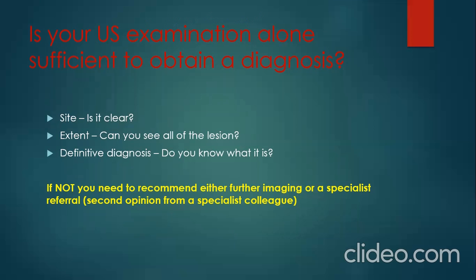After you're done with your examination, you need to ask yourself these questions to see if your exam is sufficient for you to obtain a diagnosis. The first question is, was the site clear? Did you see the extent of your lesion? Did you see all of your lesion? And are you able to give a definitive diagnosis of this lesion?